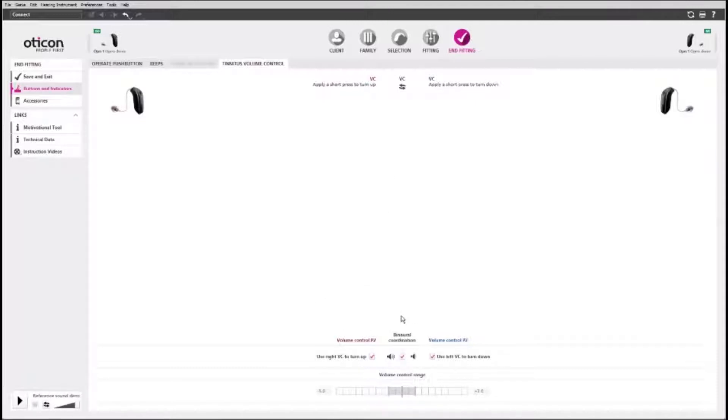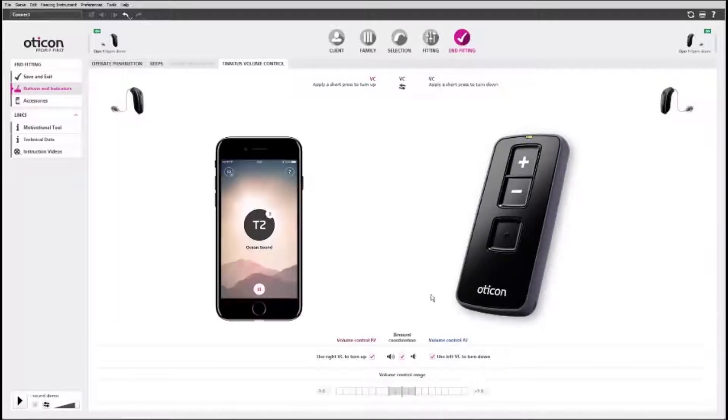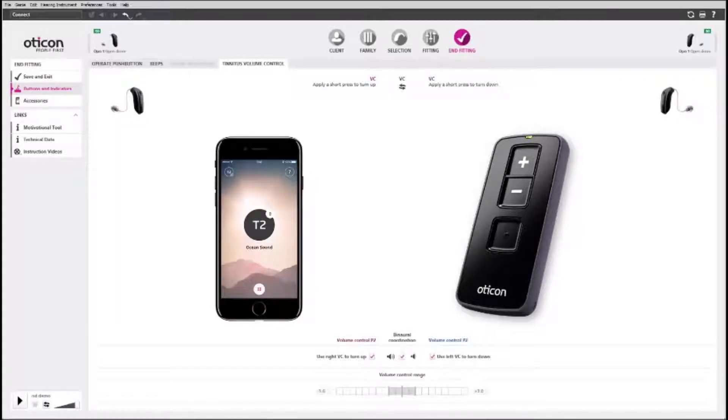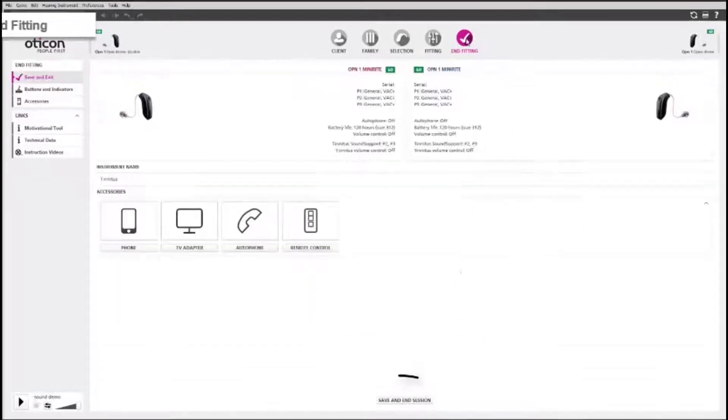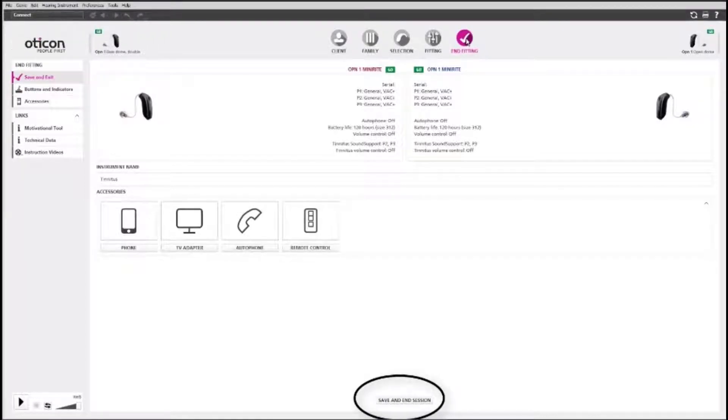When a tinnitus sound support program is on, you can still control the volume of the microphone with the remote control or via the Oticon On smartphone app. Save and end the session to conclude fitting the tinnitus sound support hearing aid.